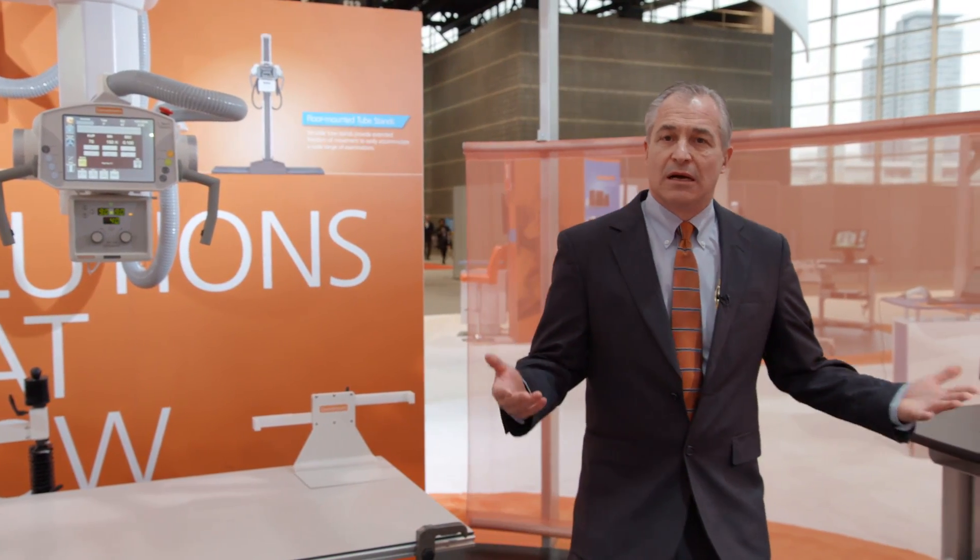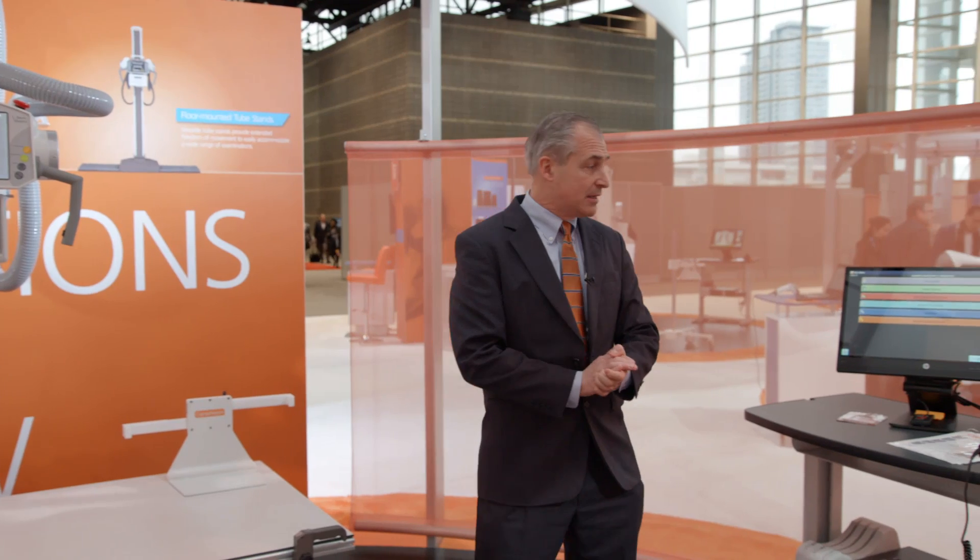Hi, I'm Steve Romacki and I'm going to walk through the Ascend system with you. It's available in analog and digital versions, and I want to walk you through all the features of that product.